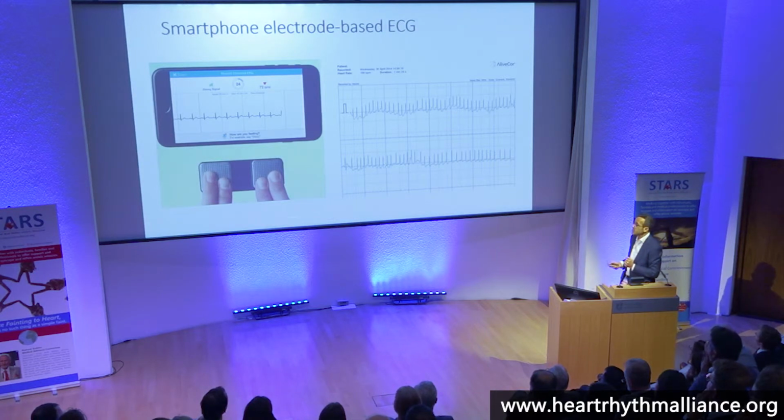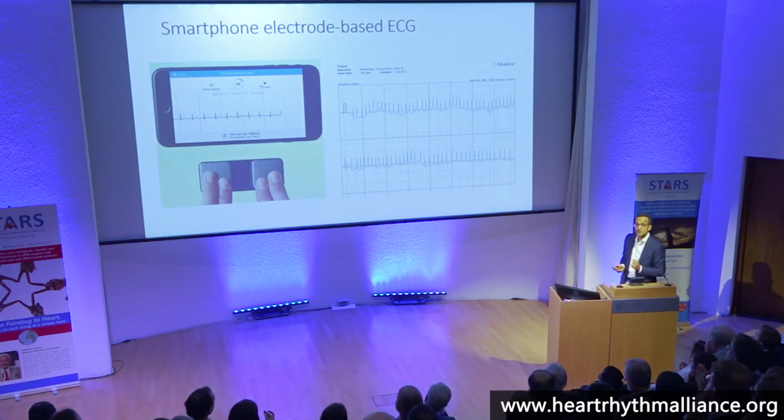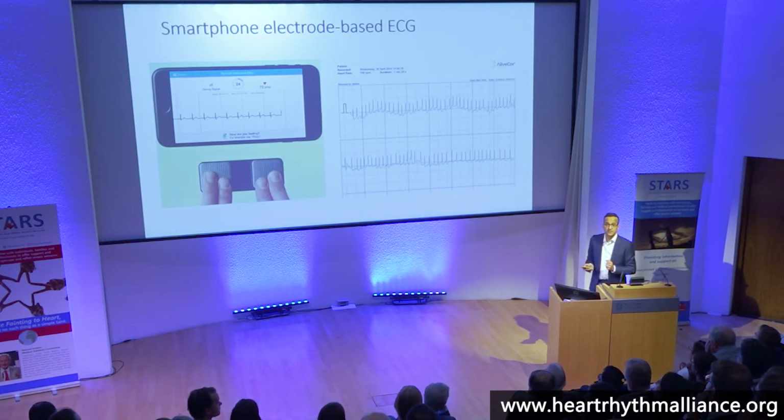Our institution supplies them as part of our repertoire of Holter monitors. They cost about, I think it's about $100 US. It's probably come down since then, but it gives you a medical resolution ECG based on 2 electrodes that you can use your fingers to document your symptoms. Okay? And the patients can download this and email it to their physician.